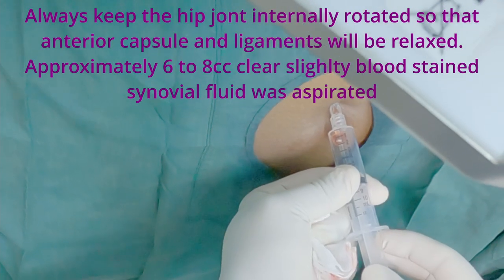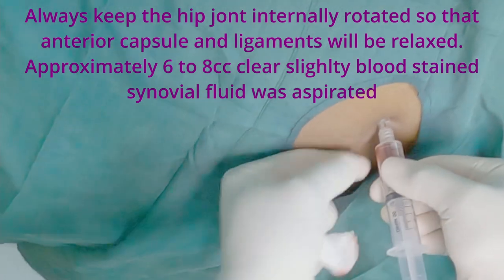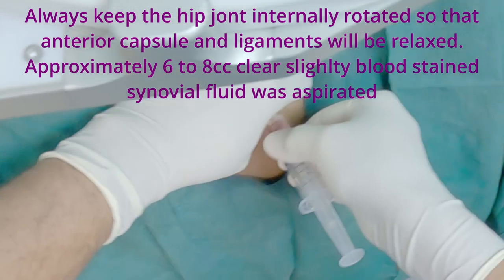During this injection procedure, always try to keep the hip joint internally rotated so that the anterior capsule and ligaments will be relaxed and more fluid will be pushed anteriorly.